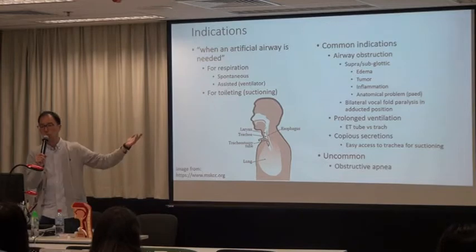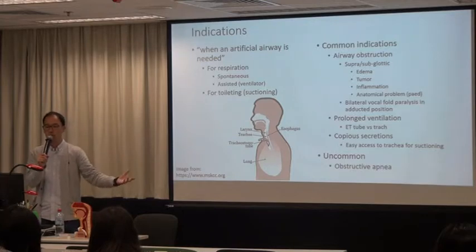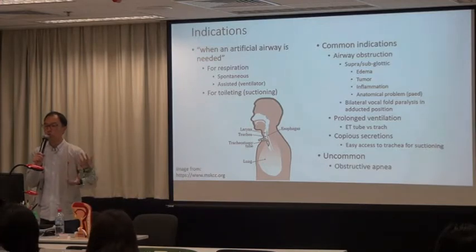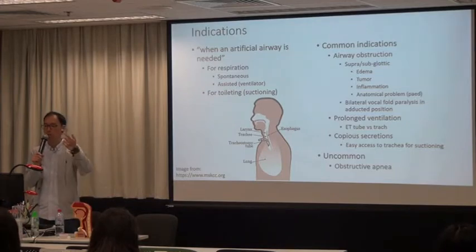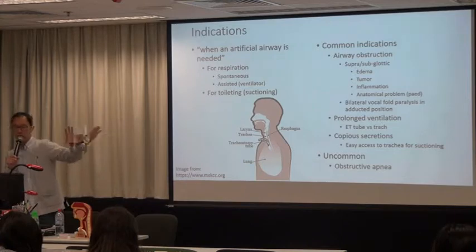Not a tracheostomy tube, what tube would that be? For patients on a ventilator, not with a tracheostomy tube. Okay, maybe we won't see these patients a lot, you won't get called to see these patients often, but sometimes we still do. They call it an ET tube, right? An endotracheal tube.